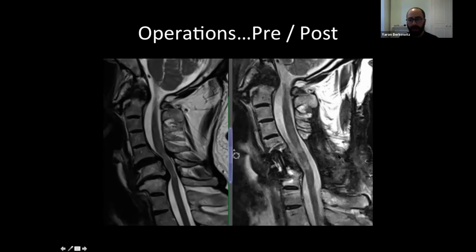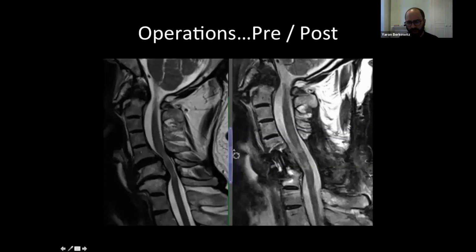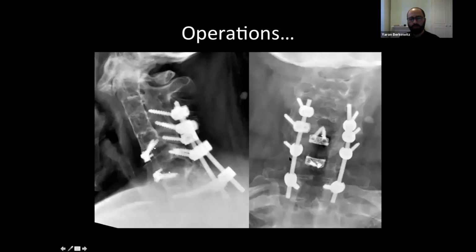So they've had an anterior fusion with a corpectomy, which is the removal of the vertebral body, as well as a posterior decompression. And because they've done the posterior decompression, they've had to fix the back. And because they've done an anterior decompression, and removed some of the vertebral body, they've also put a cage in situ at the front as well. And corpectomies aren't always complete, so you can actually still see this vertebral body. But on the MRI, you can see that they've removed some of it. So what they've done here is they've removed the central component of the vertebral body, but left the far lateral components in situ. And that way they've still got some bony construct to work with.